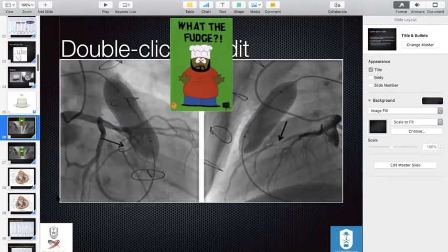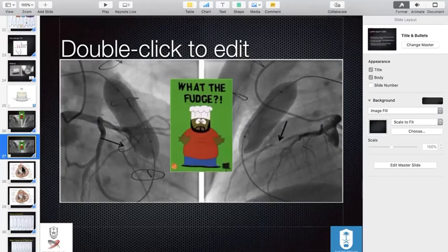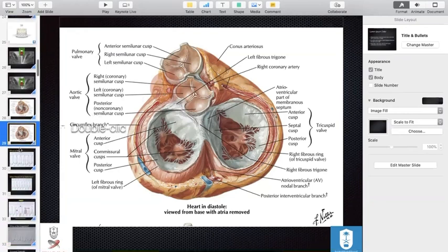So it's always a default strategy to test the coronaries before you embark on a valve deployment at the pulmonary level. And you can see here why we're saying that. This is the aortic valve. You see here the pulmonary valve, and this is where the left main takes off. And if you balloon here, you might compress the left system, whether at the left main level, or if you go lower, you might at the LAD level, as we saw in the previous example. Okay. Any questions about that case?